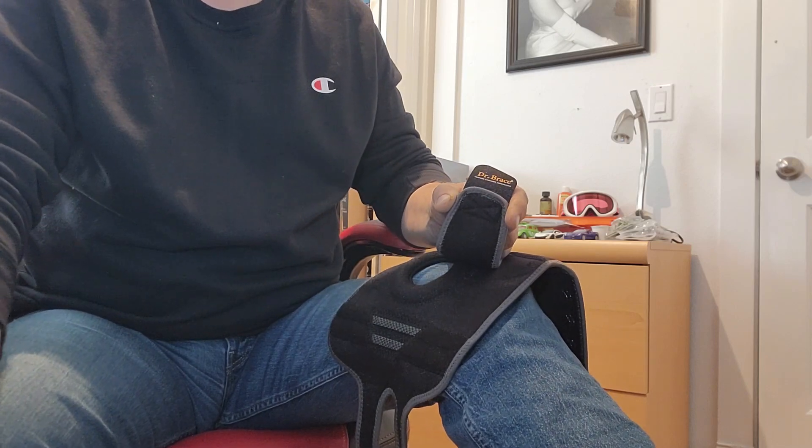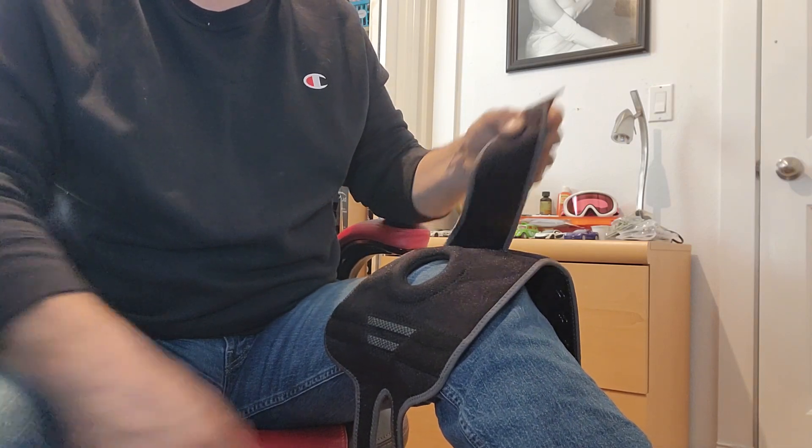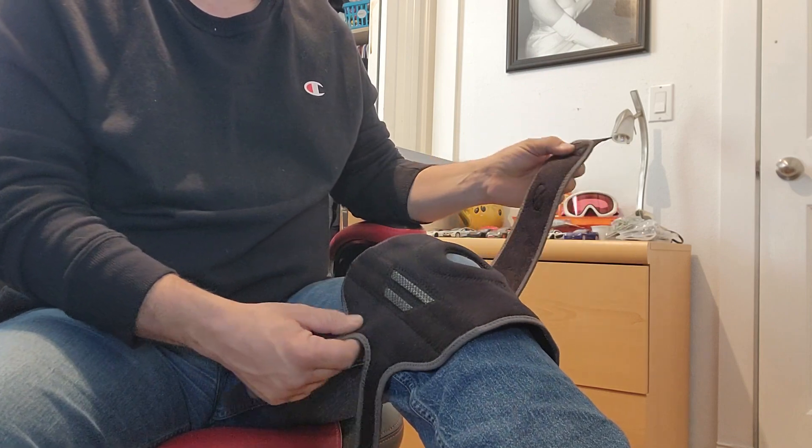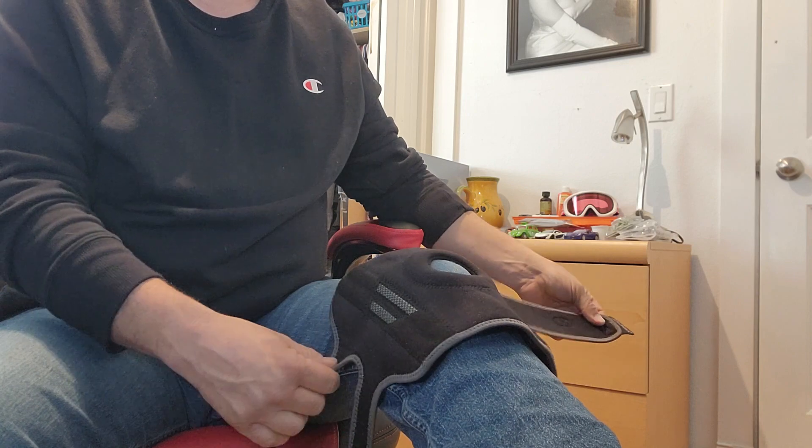Hey guys, just want to do a quick review here for you on the Dr. Brace knee brace. I did receive this in exchange for my honest review of it and overall been very impressed.